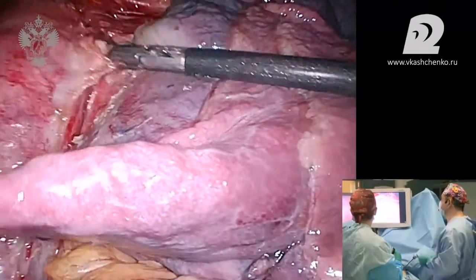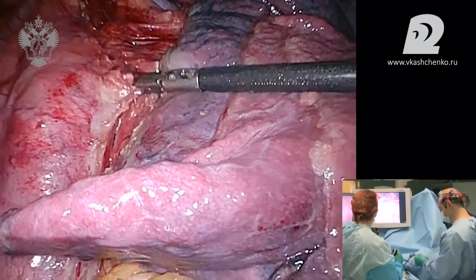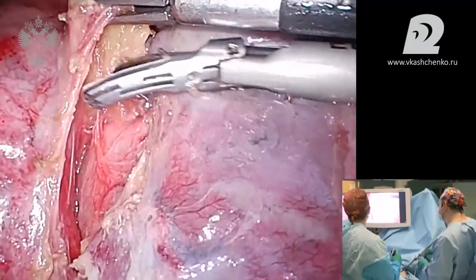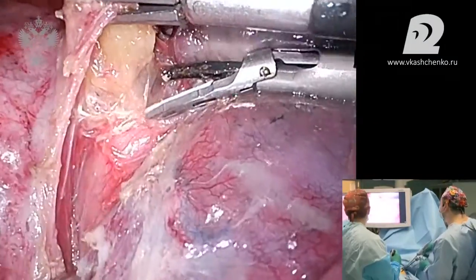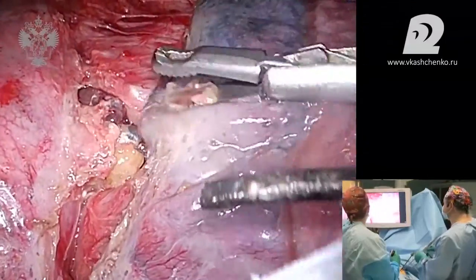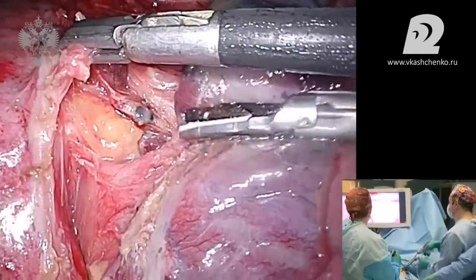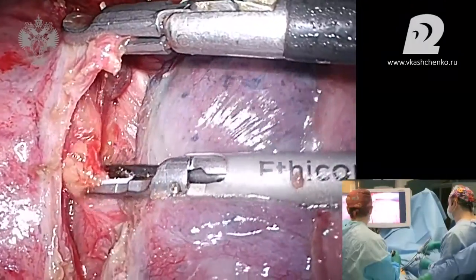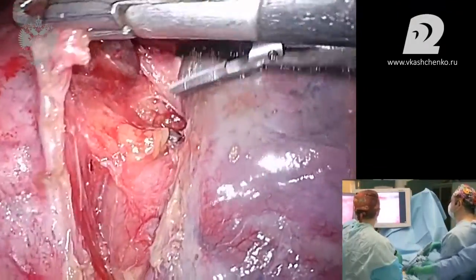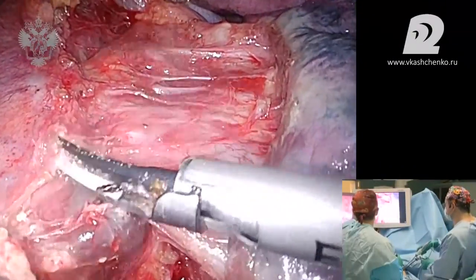And from the intermediary bronchus, you can see some group with some lymph nodes. Can I have a harmonic? Can you come closer? Please do. These are lymph nodes which are in the pulmonary parenchyma, and that is why we are not going to get mad about it. These are lymph nodes which are under the intermediary bronchus. Can you show it from above? Thank you. You can see it pretty well.